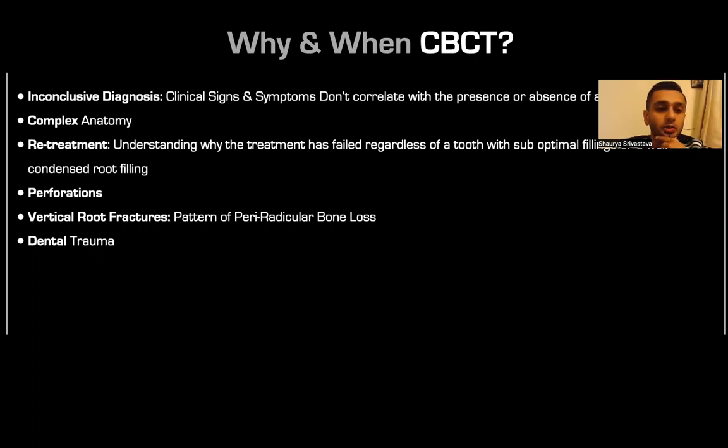Then dental trauma as well. We will talk about that very briefly. Since we just have an hour, I've tried to compile a case of each kind to show you why CBCTs. Okay, so we won't get into too much depth. We can't teach you how to use a CBCT, but we can teach you why you should refer a CBCT.